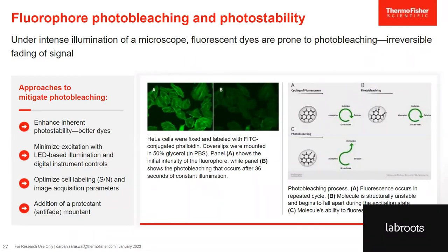So how can you overcome the photobleaching issue? There are a lot of ways you can do that, like choosing a more stable dye. If by any chance you don't have the option of choosing a more stable dye, you can choose more stable counterstains like DAPI to find focus and orient your cells, and then switch over to the dye which is photolabile and take the image as quickly as possible. Reduce the laser power or LED voltage. You can also reduce the time for visualizing the sample by eye before capturing the image. Use lower power magnification objectives, or objectives with a lower numerical aperture, to find your samples. And if you are doing confocal imaging, you can reduce the average number of scans per line.